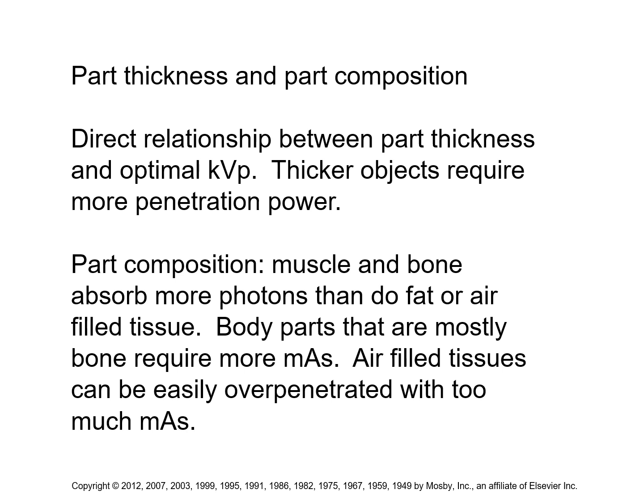For example, the neck and the knee are roughly the same diameter and circumference. So go ahead, put your hands around your knee, right? And notice that your thumb and your middle finger can touch, and you can completely circumscribe your knee, or it's really, really close. And then do the same thing for your neck, and you notice that the size of your knee and the size of your neck are almost exactly the same. So you could use the same technique, right?